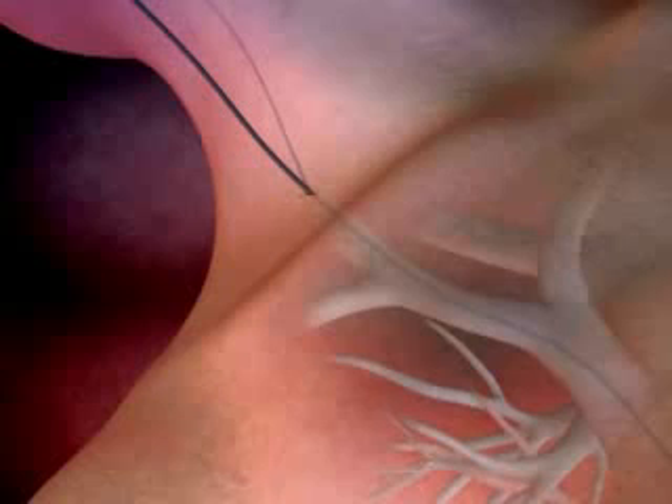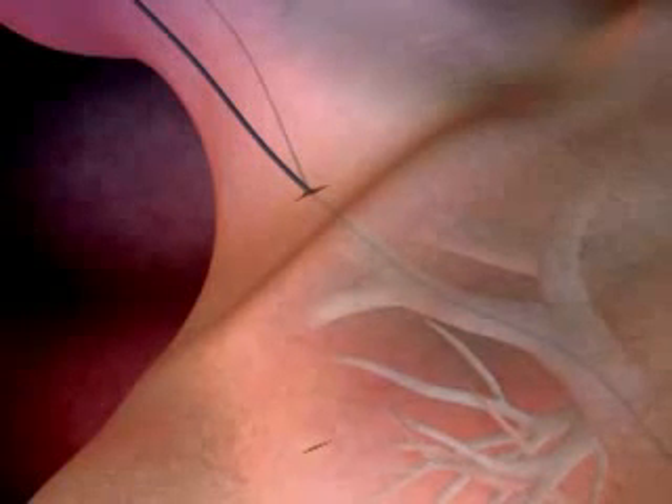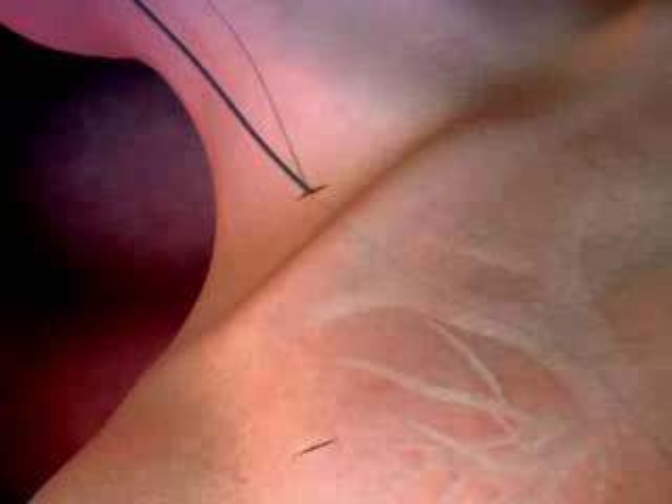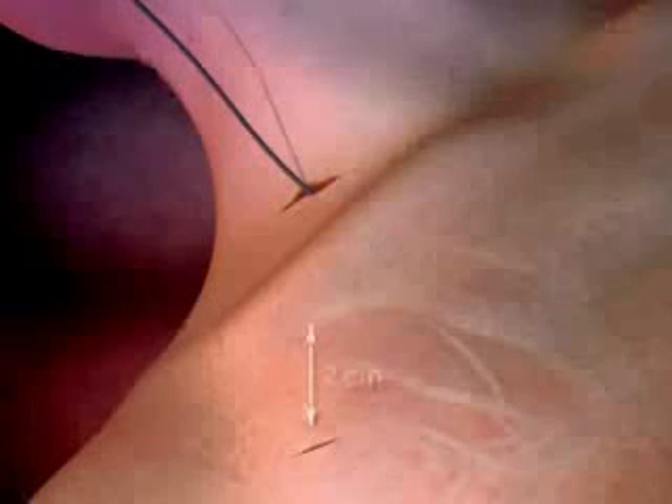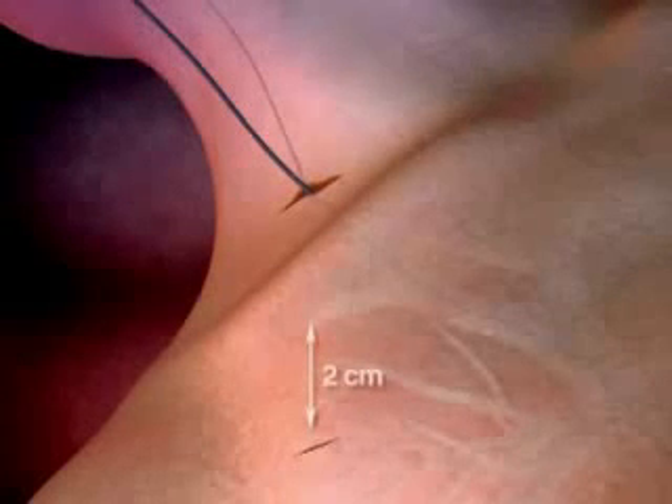Enlarge the insertion site. Make a small incision at the catheter exit site on the chest wall to accommodate the cuff. Use blunt dissection to create a tunnel opening in the subcutaneous tissue. The distance of the tunnel should be short enough to keep the Y-hub of the catheter from entering the exit site, but long enough to keep the cuff two centimeters from the skin exit site.